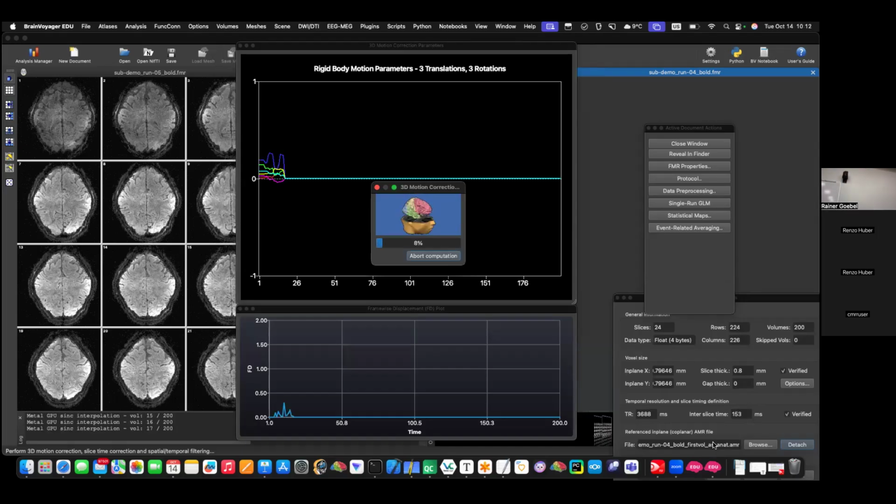And now you see, this is now important, it does not start at 0. You see on the left side, these are the motion parameters across the runs. It's small. If you would go to run 1 or 2, it would be much bigger, because run 4 to run 3 is not so much displacement. So the plots have the added volume added, right?